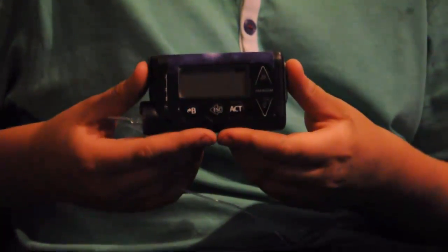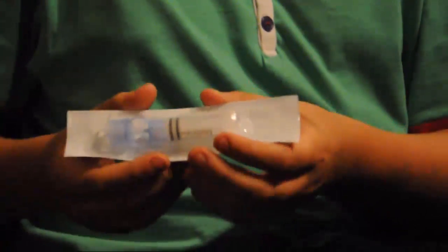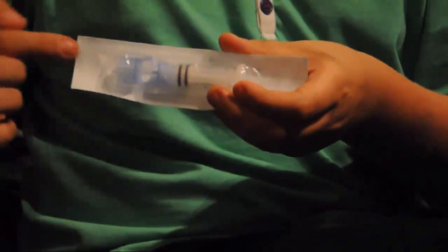These are the things I need for my insulin pump change. This is the insulin pump that I will be changing. This is the infusion set with the cannula and needle and the tube which connects to the reservoir. This is the reservoir. The insulin will be going inside there and the insulin vial will connect to the top, which has the insulin in it.